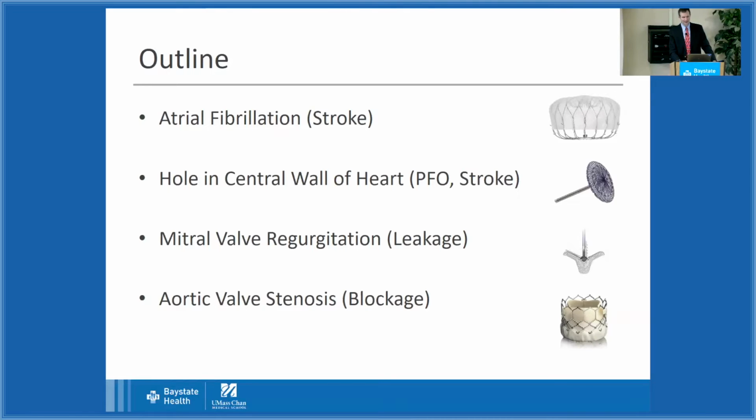And lastly, aortic valve stenosis. A stenosis is a blockage of the aortic valve. It doesn't open appropriately, and we can actually replace the valve entirely in a catheter-based procedure. So here we go. You ready? Go.